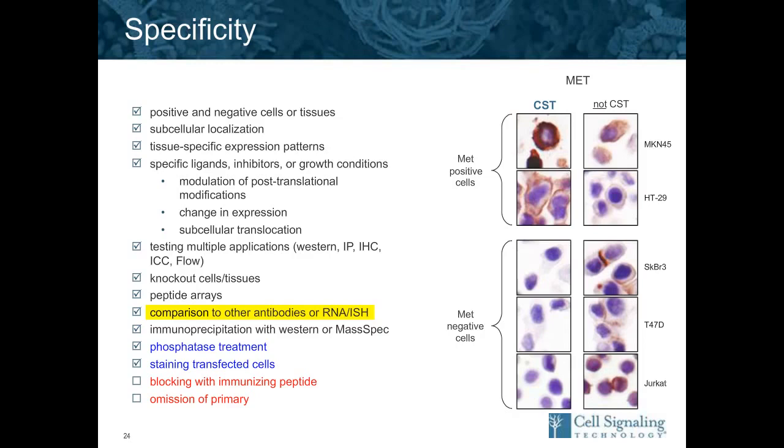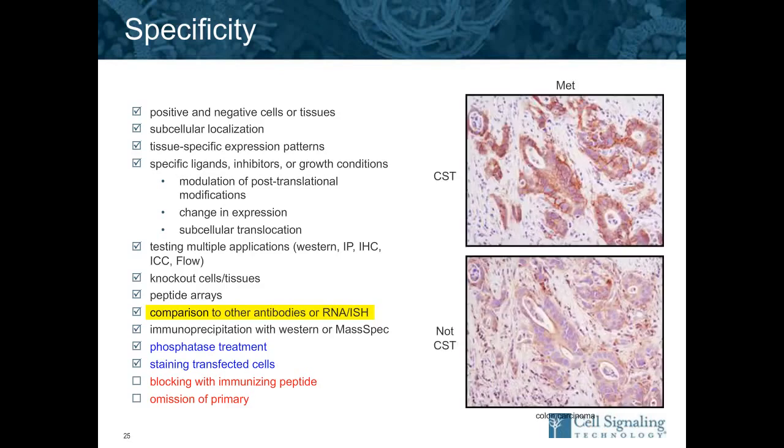There's an example now showing MET. So in this case, we were using formalin-fixed paraffin-embedded cell pellets that either express MET, like the two on the top, or do not express MET, like the three on the bottom. As you can see, the CST antibody on the left is only staining the positive cells and is not staining the negative cells. However, the other antibody on the right is light in one of the positives and actually positive in some of the negative cells. When this is then taken to tissue, you can see, again, nice clean membrane stain like you would expect from MET, whereas with the other antibody, kind of mushy stain that's all over, and the localization does not match what would be expected from MET.